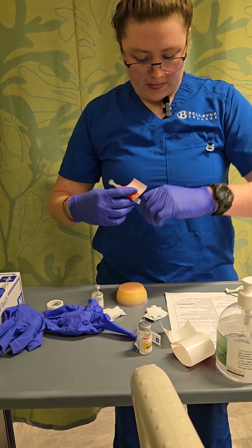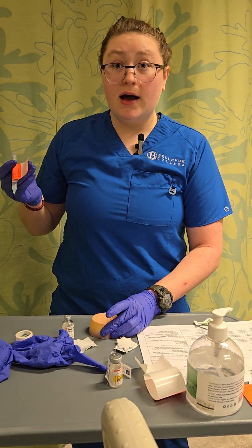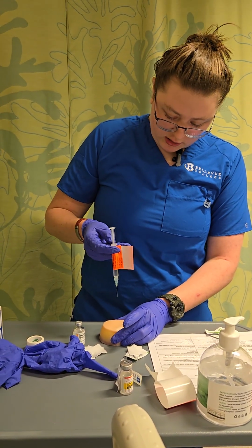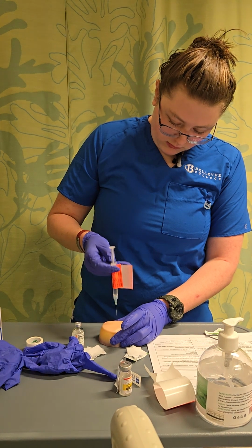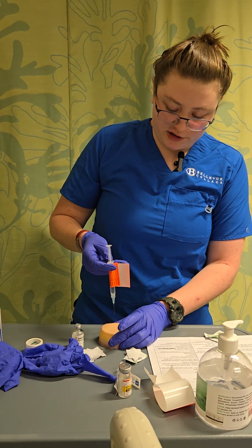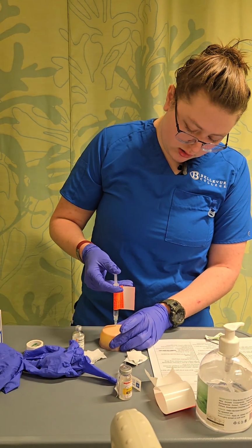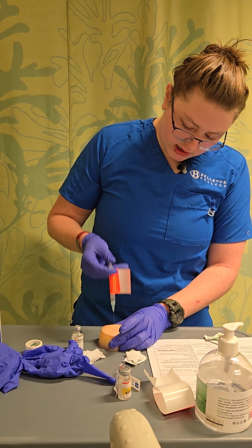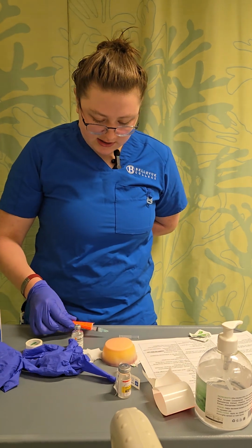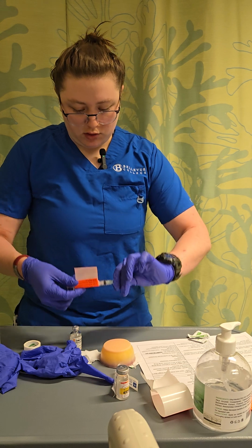Perfect. Cool. All right. Now that it's dry, I'm going to uncap my needle. I'm going to grab, and we're going to go straight at a 90-degree angle here. And again, we'd already be doing a Z-track, but this device is not big enough for a Z-track. So, all right, injecting 3, 2, 1, all the way down. Good. Doing great. 1, 2, 3. Good work. Okay, and then I'd recap this. Maybe there we go. Cool.